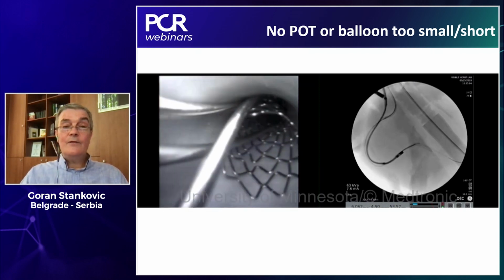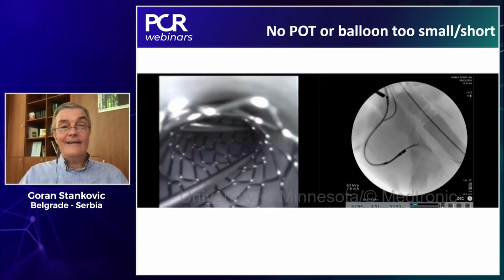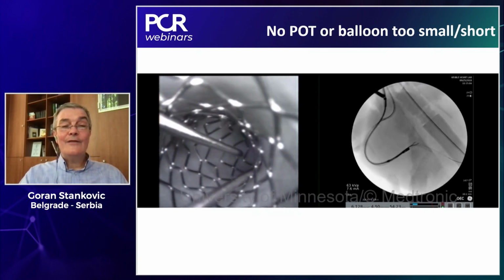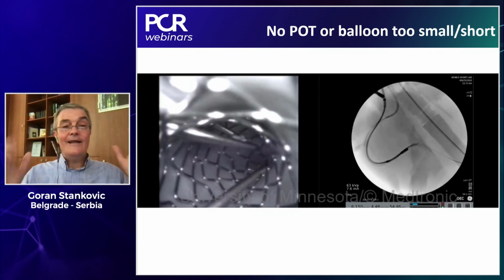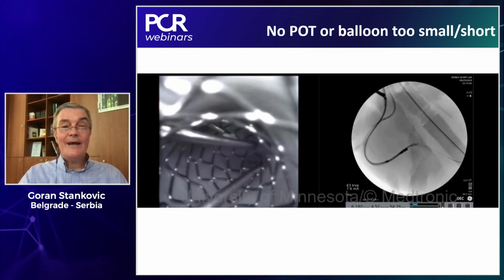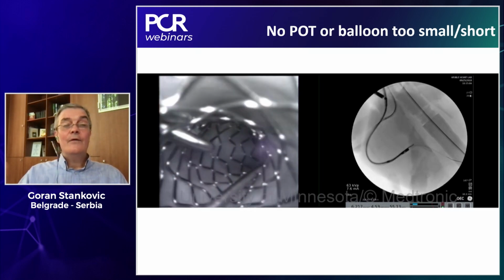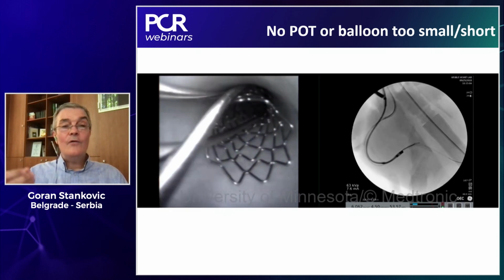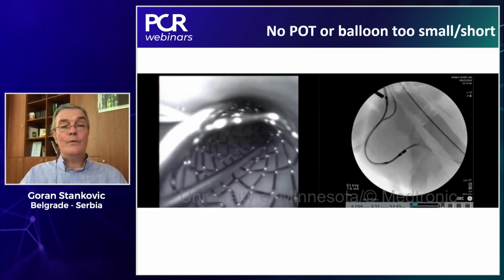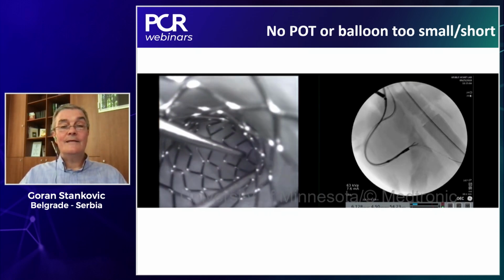Jens, I'm sorry that we removed your images, because you were the operator in this specific case, and it was really funny to look at your face with really clear surprise in your eyes, because you were not expecting this wire to go in and out of the stent without any resistance, without tactile feeling to transmit. What was the main message for you when you did this?